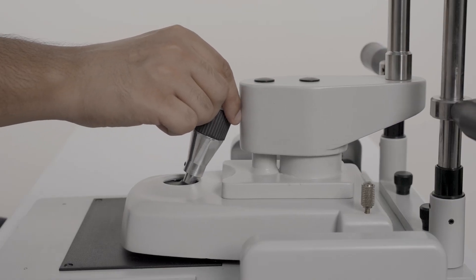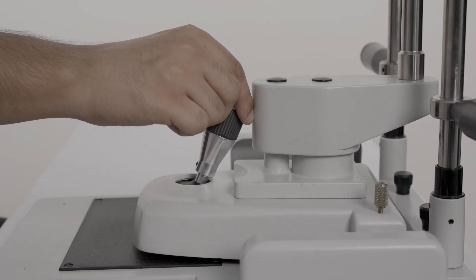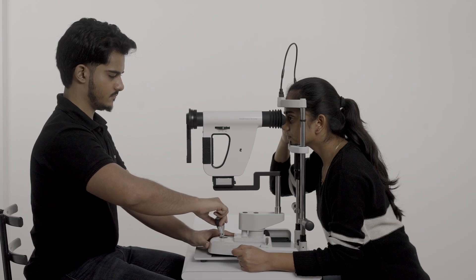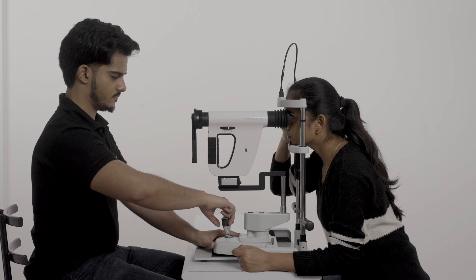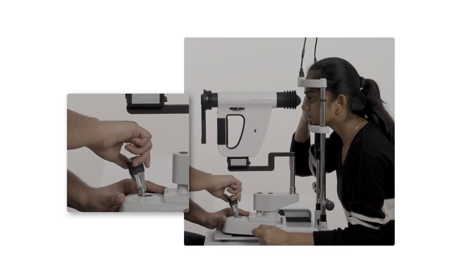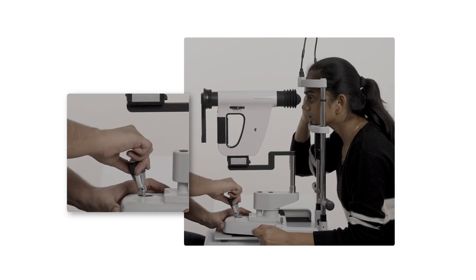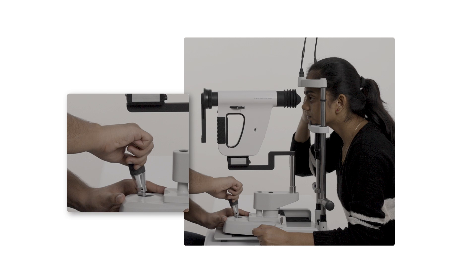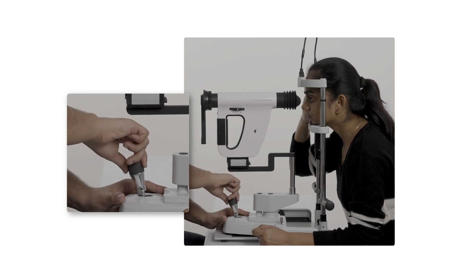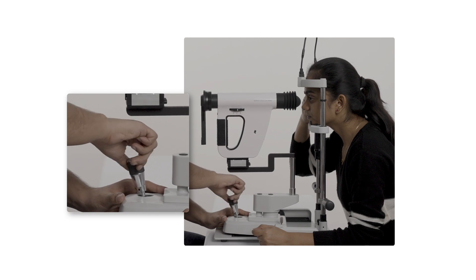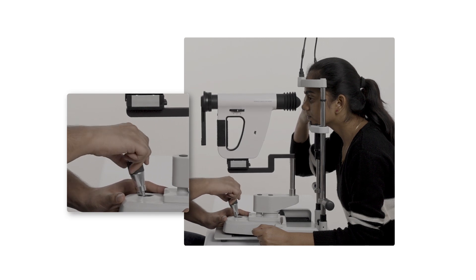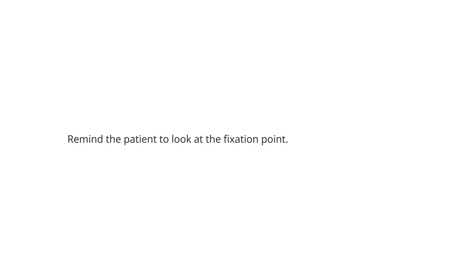Move the joystick around to bring the FOP into position. Rotate the joystick clockwise to move it upwards and anticlockwise to move it downwards. Don't forget to remind the patient to look at the fixation point.